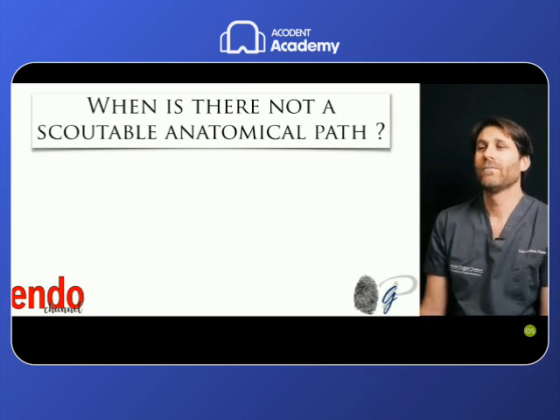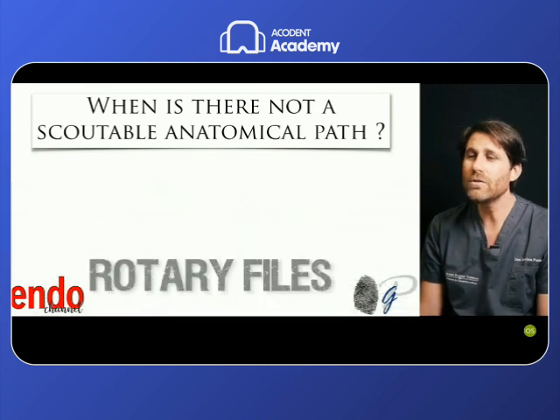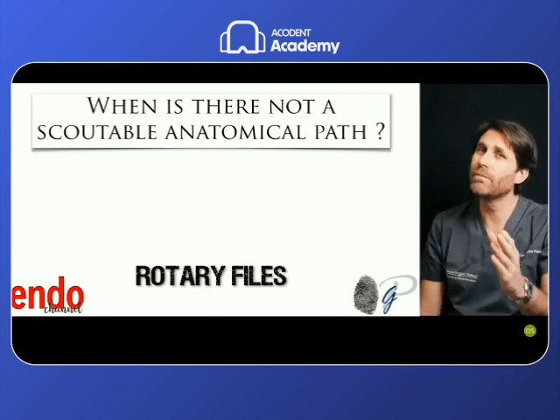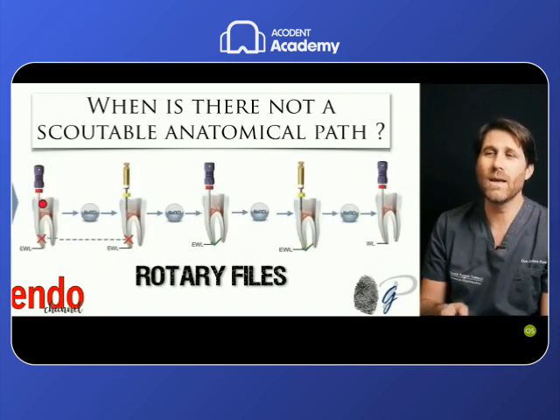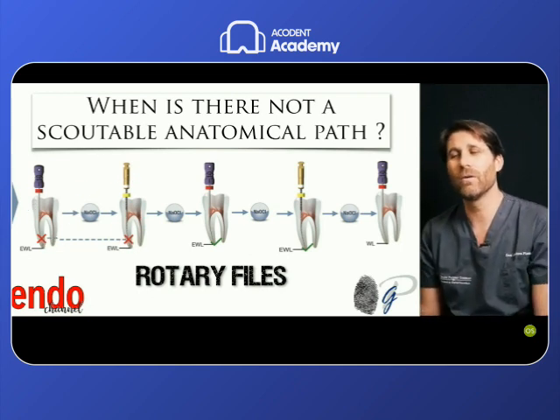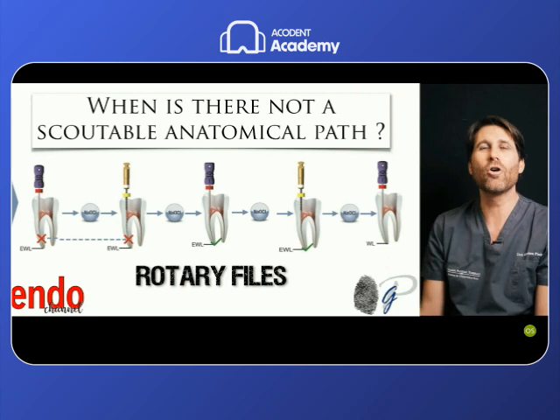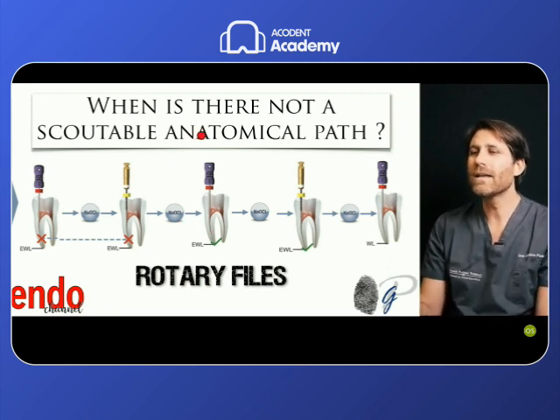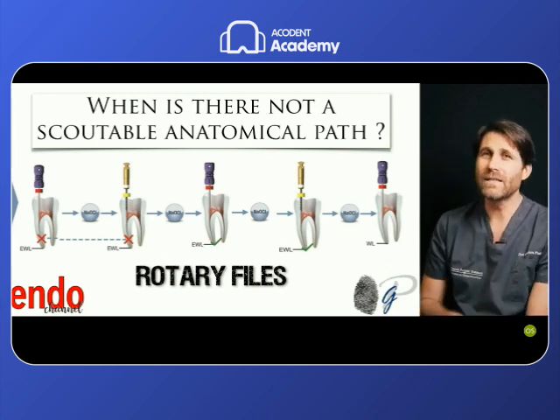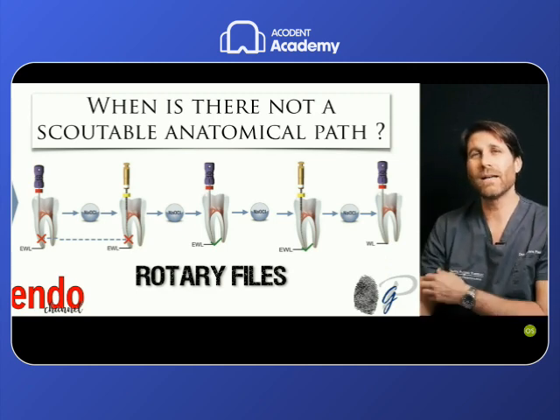We know that when a scoutable anatomical path is not possible, if we use rotary files, our habit was to scout the root canal up to the point where we were able to go with the 10 file, then to use a mechanical file up to the point in which we reach the working length in rotation, the sequence of files, thus performing a coronal preflaring. Then we try again with the 10 stainless steel file to reach the working length. And we know that most of these cases of apical unscoutable canals with rotary files were given by coronal interferences.